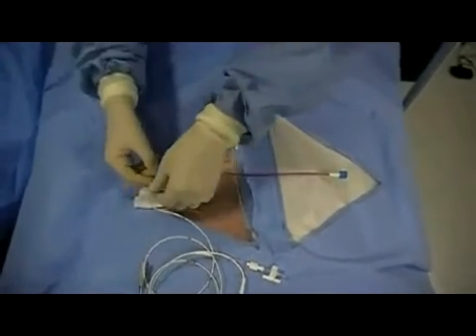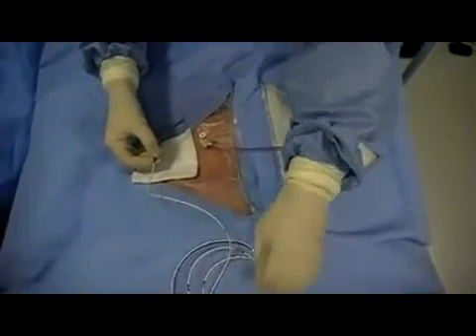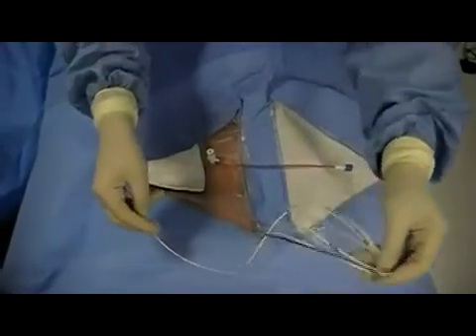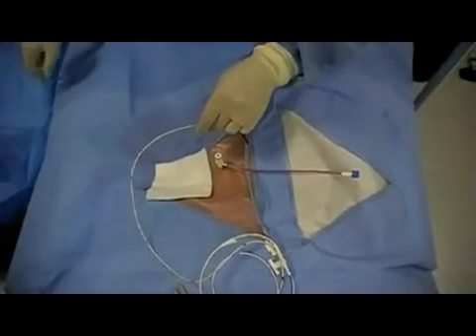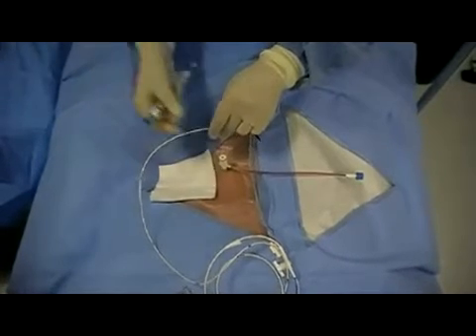The unique features of this wire are a protective shield, which not only protects the distal tip of the pacing wire but maintains the curvature to successfully float the pacing wire. It is important when uncoiling the pacing wire to maintain its original curvature, which is designed to facilitate entry into the right atrium.